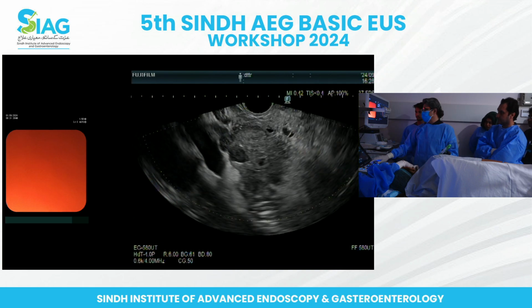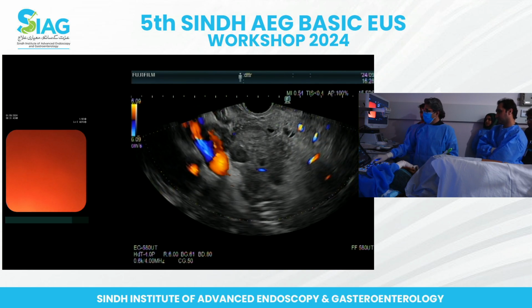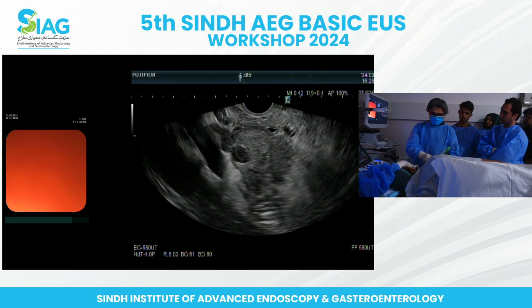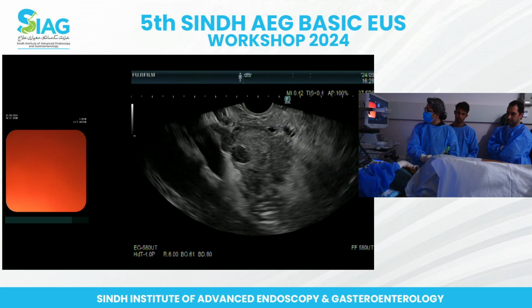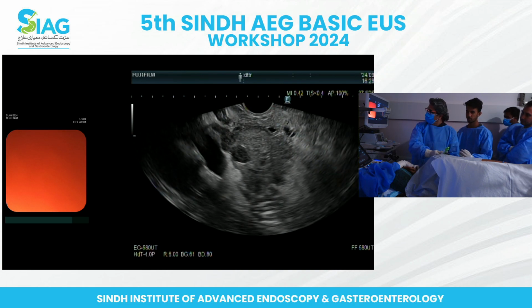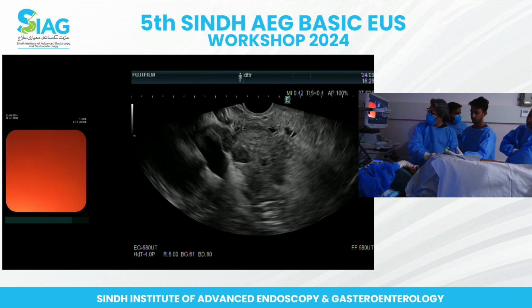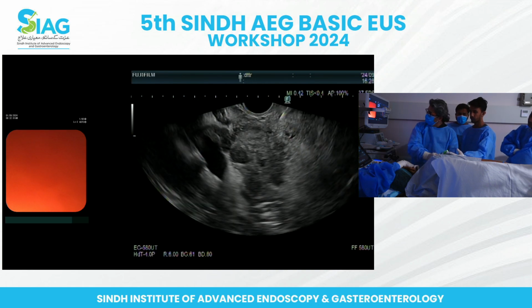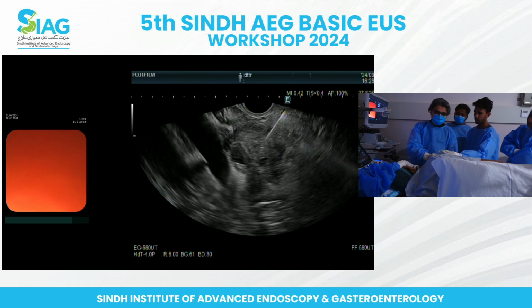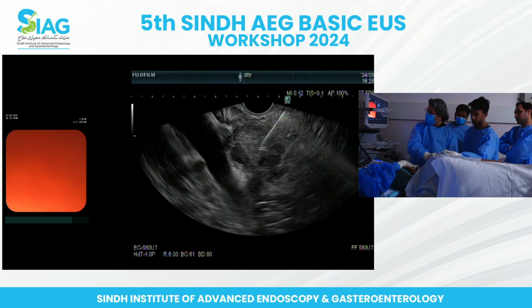So I think this is probably the best shot we're going to get. Yeah, I think so. It seems like the least harmful area. Yep, yep. So again, we'll just push it a bit there. Okay, so push it back in. And now slow pull for me, please.